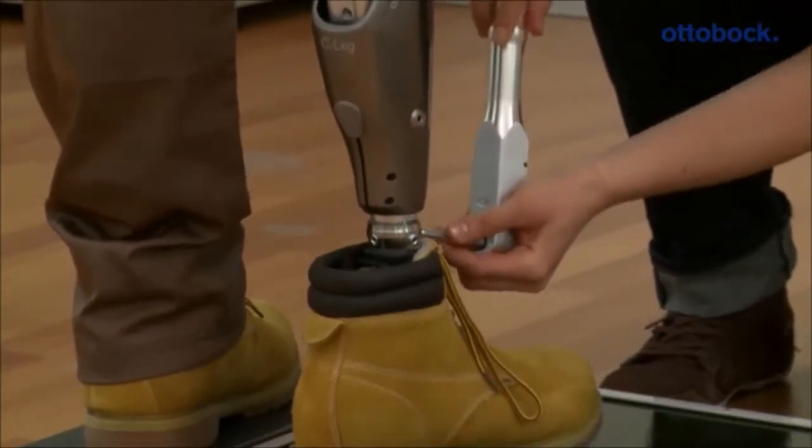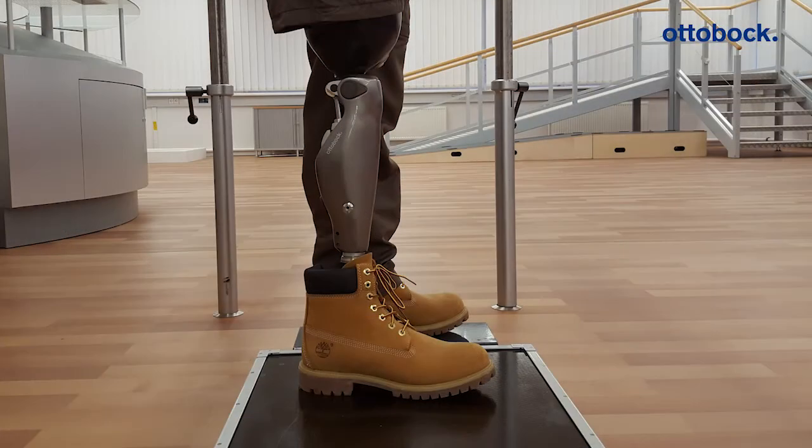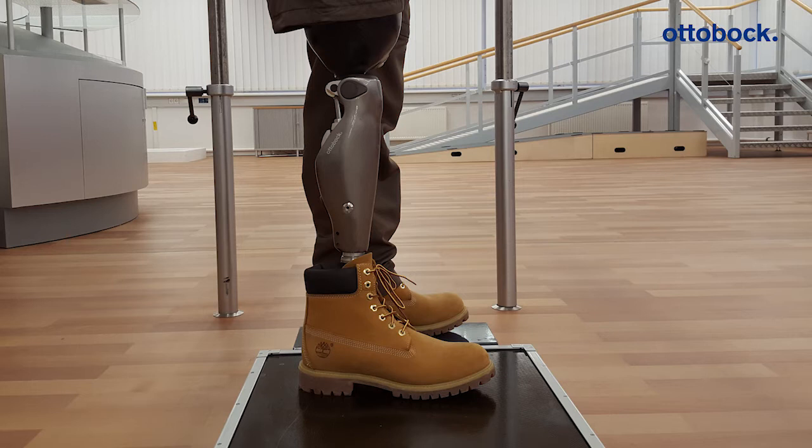For a correct calibration, ensure that the user is standing in his or her natural upright position and that the user's body weight is distributed evenly on both sides.